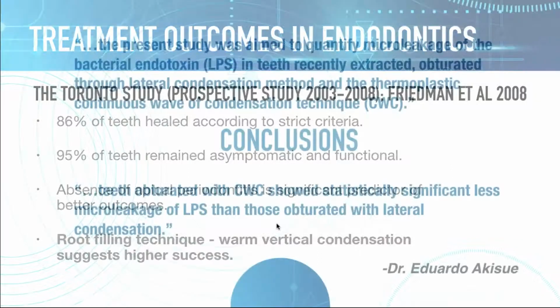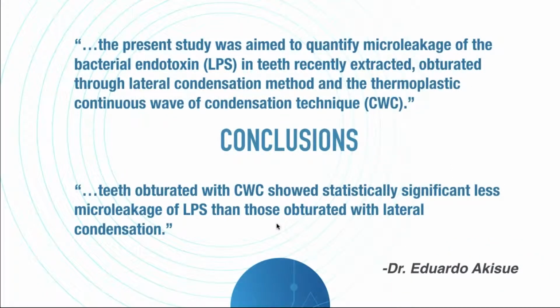Eduardo Akasui, University of Sao Paulo, wanted to quantify the microleakage of bacterial endotoxins in extracted teeth that were obturated with either cold lateral or warm vertical, specifically the continuous wave of condensation. And what Dr. Akasui found was that teeth obturated with the continuous wave of condensation showed statistically significantly less microleakage of bacterial endotoxins than those that were obturated with lateral condensation.